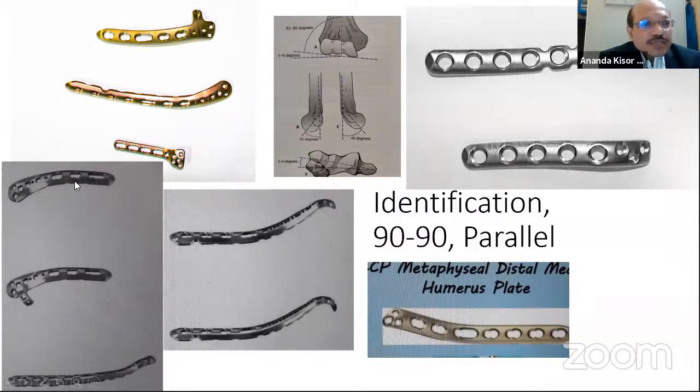So see, this is the lateral plate placed with post, and this is the lateral plate, and this is the medial plate. Medial plate is usually placed on the medial column, and with some curvature. Sometimes there is a curvature which embraces the medial epicondyle. Medial epicondyle is much more projected. See the anatomy, medial epicondyle is much more projected. So if there is a much more projection like this, it cannot be the lateral plate. That should be the medial plate, because through this plate one screw can be introduced from below upwards. So these are the lateral plates and these are the medial plates.